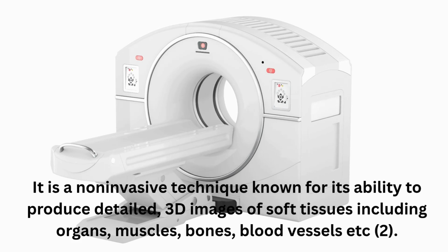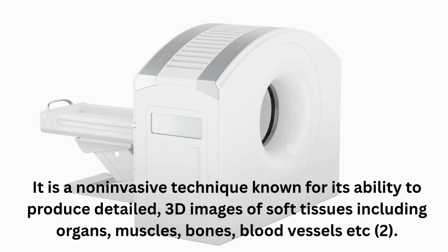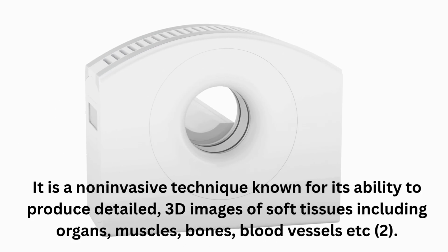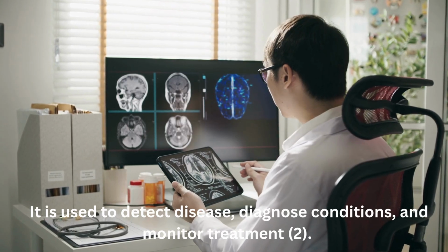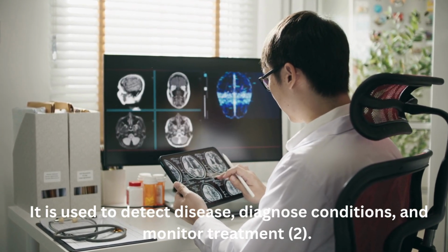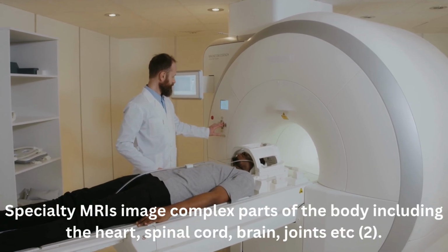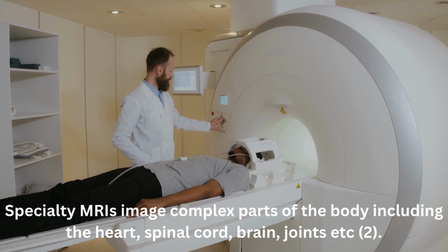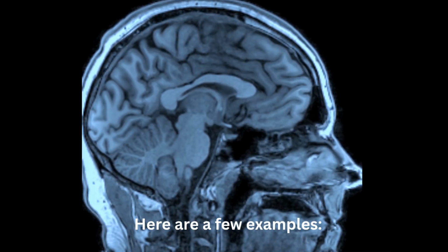It is a non-invasive technique known for its ability to produce detailed, three-dimensional images of soft tissues, including organs, muscles, bones, and blood vessels. It is used to detect disease, diagnose conditions, and monitor treatment. Specialty MRIs image complex parts of the body including the heart, spinal cord, brain, joints, etc. Here are a few examples.